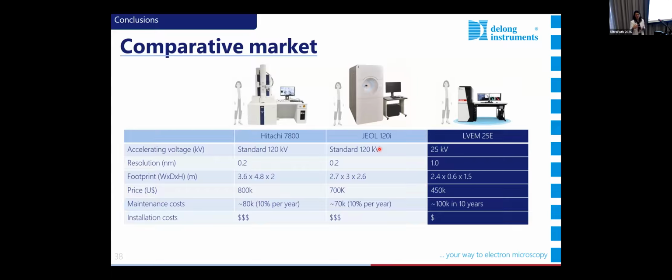There's no cooling system, and even the room temperature is normal; you don't need a very controlled room temperature. So it's lower. But we never said it's nature friendly, because we never did any calculation, environmentally friendly, let's say. But I would imagine, yes.